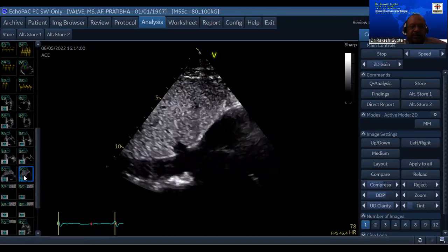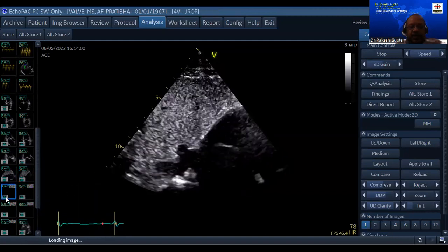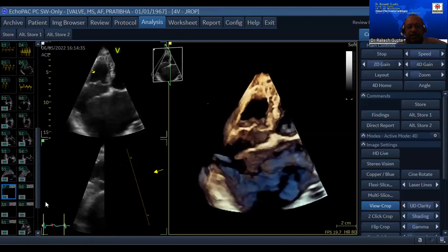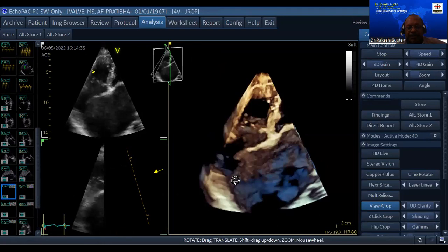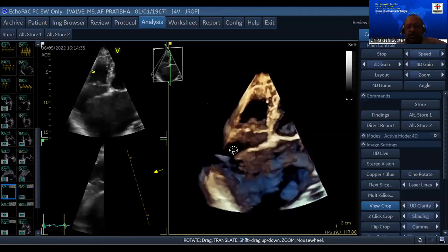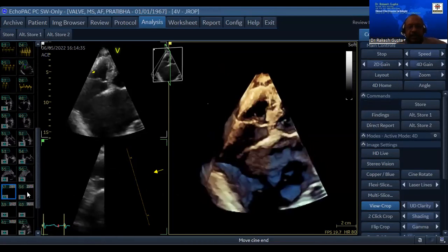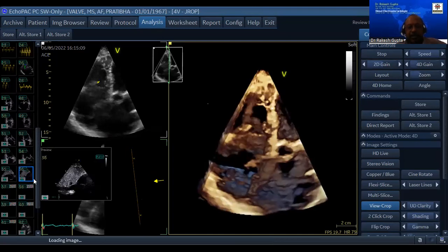And this is a very interesting finding. I'll come back to you. IVC is dilated. This is approximately a 3-dimension echocardiography. And look in this 3-dimension echocardiography, what is happening to the interatrial septum? It's bulging towards the right side, suggesting that LA pressures are very high in comparison to RA pressures. And this is seen in a very good format once you are doing a subcostal window.